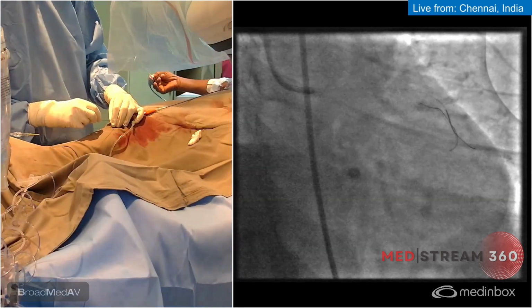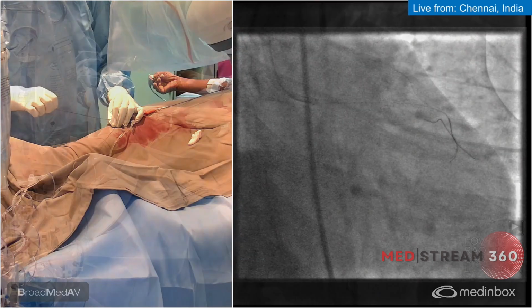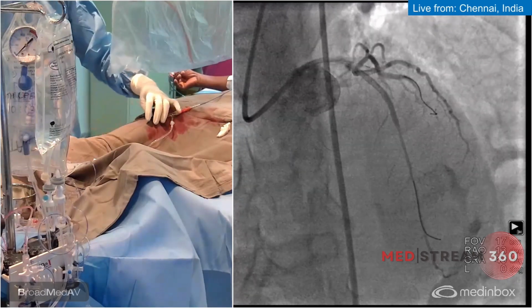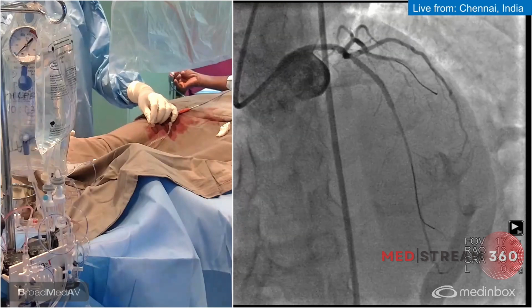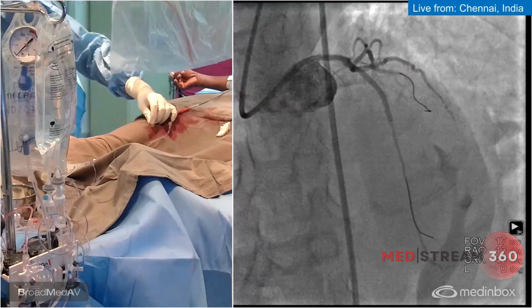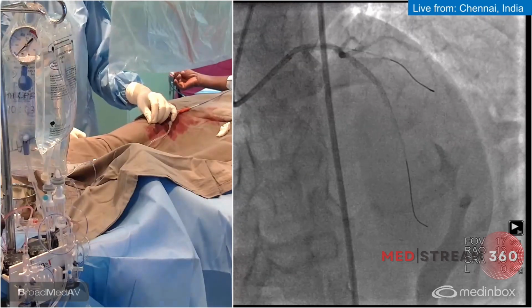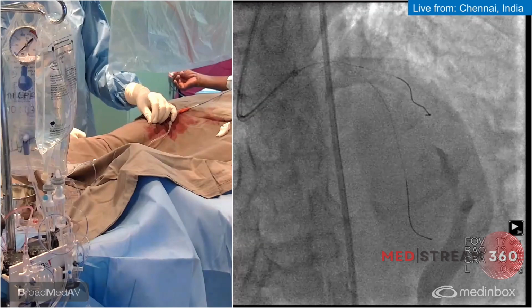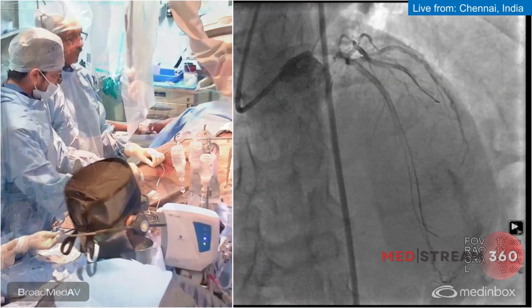26 is coming because the guide was into the left main. I thought another 4 millimeter. Okay, I think that's good. I think angiographically it's in fact bigger than the distal vessel. So 2.5 was the right size. Now the question is 26 or 30. So what we'll do is, I will use a 30 and keep it a bit overlapped in the LAD, because there is no reason for us to worry. There are no major branches there.